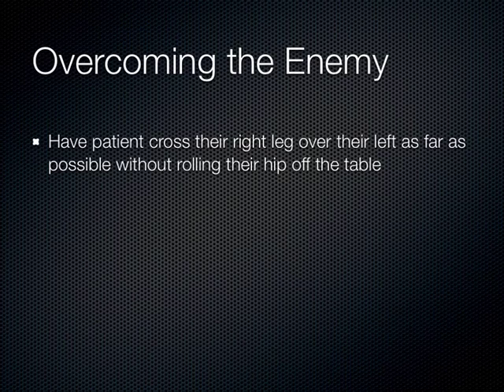On my earlier demonstration, I forgot to do that, but I think it's important to put the right leg over the left leg as far as possible without the patient falling off the table. And then you're going to push really hard. You're going to push harder in the abdomen than you've ever pushed before with an ultrasound transducer today.